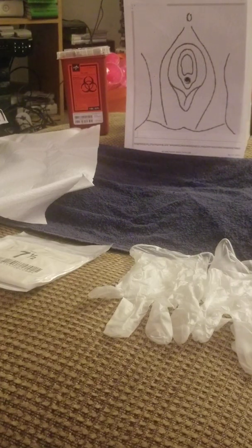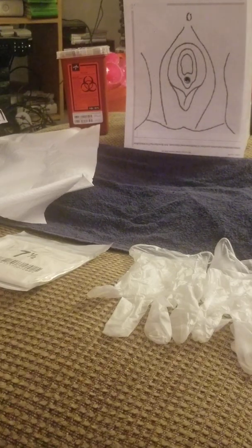And also, I'd like to note that my sharps container, which is my disposable container, is in an area that I could reach. My sterile gloves are there. My clean gloves are there. Everything is in reach. I have a trash can also close by if I need it. So my setup is pretty much where I need it to be. Obviously, when I am in a hospital setting, I would most likely have everything on a tray table or something next to me, which would be a little bit more convenient.